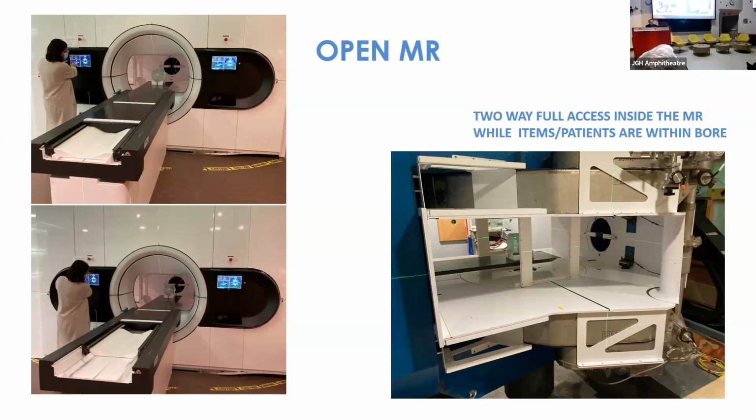And either talk to the patient if you need to. We've had cases like that that actually helped, or move the phantoms, their test objects, to make sure. The nice thing about this is that MR couches are not very accurate. So although you put a laser and you move it in, the couches move a little bit, because in MRI you don't need the precision and accuracy that you need in radiotherapy. But then we've added a laser for positioning right inside the magnet.